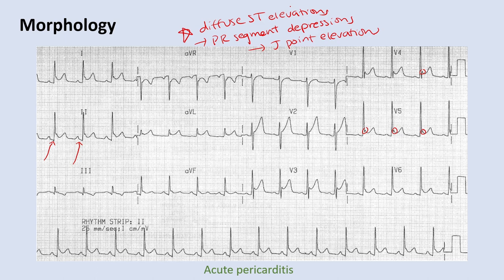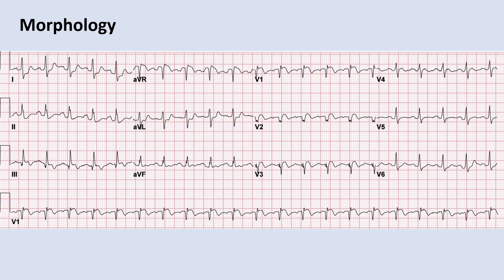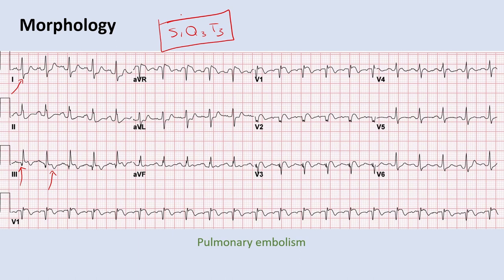In this EKG, you see an S wave in lead 1, a Q wave in lead 3, and an inverted T wave in lead 3 — the S1Q3T3 pattern, which is pathognomonic for pulmonary embolism. This is a commonly tested question. However, note the trick question: the most common EKG finding in pulmonary embolism is actually sinus tachycardia, not S1Q3T3. Also, S1Q3T3 can be seen in other causes of right heart strain such as pulmonary hypertension, right ventricular hypertrophy, or right atrial enlargement, so it's not exclusively PE.